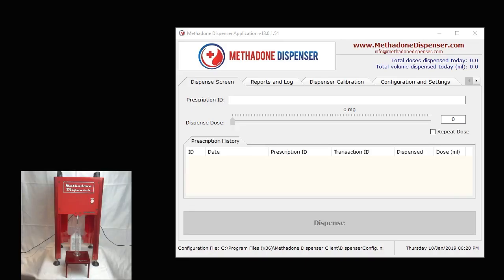Hello. In this segment of the tutorial, what I wanted to cover is calibration. Calibration is very important. We usually recommend running a calibration process on a daily basis before you start using the dispenser for the day. What calibration allows you to do is to fine-tune the accuracy of your medication being dispensed. It is a very simple process. Usually manual pumps need to be sent out for calibration periodically.